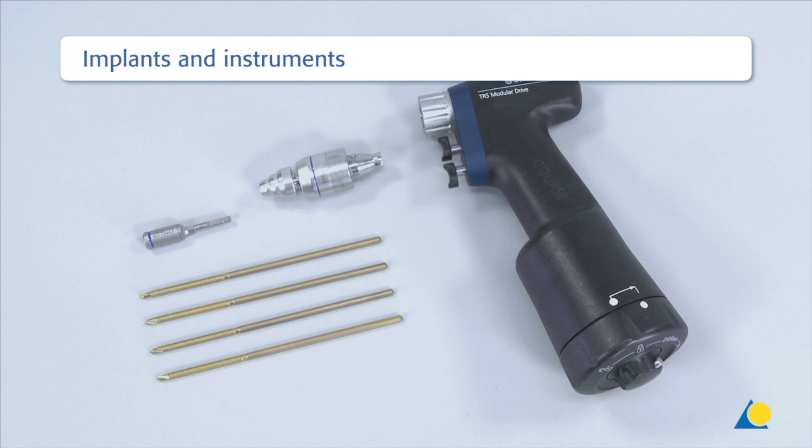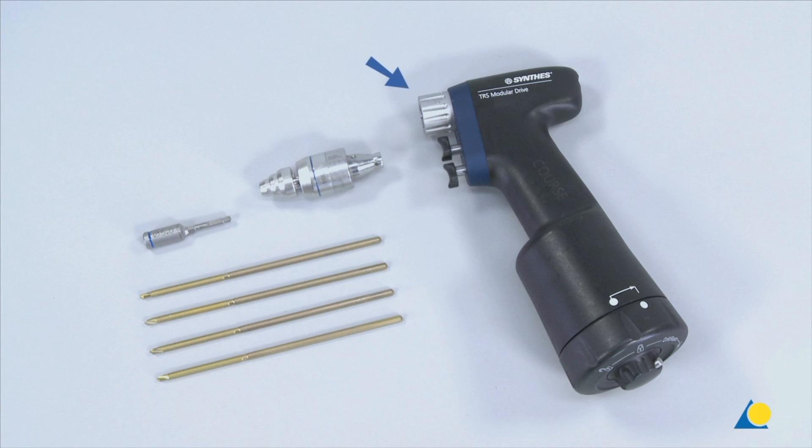The implants and instruments needed for this exercise are: the power tool, the quick coupling, the drive adapter with quick coupling for 5 mm Schanz screws, and four 175 mm long, 5 mm diameter, self-drilling Schanz screws with a thread length of 60 mm. Conventional Schanz screws may be used as well.